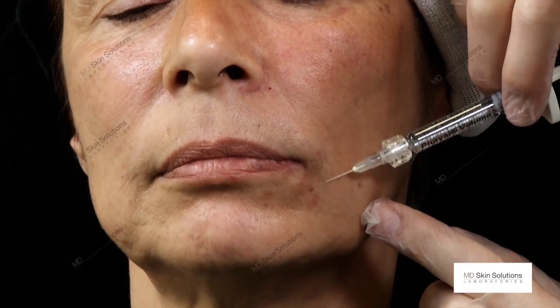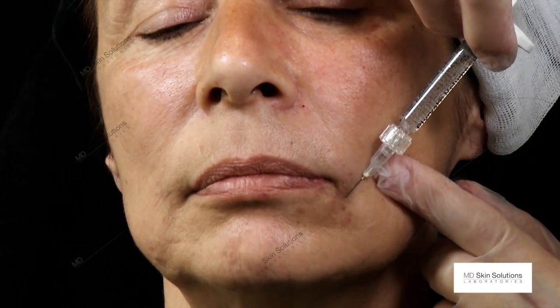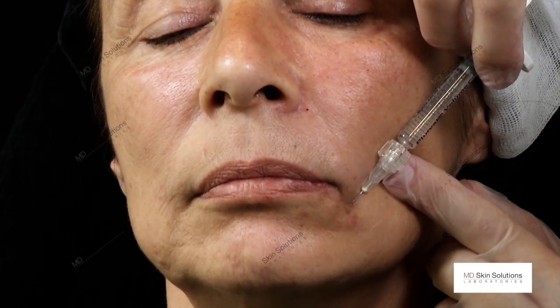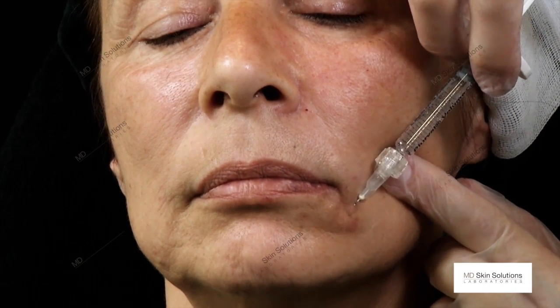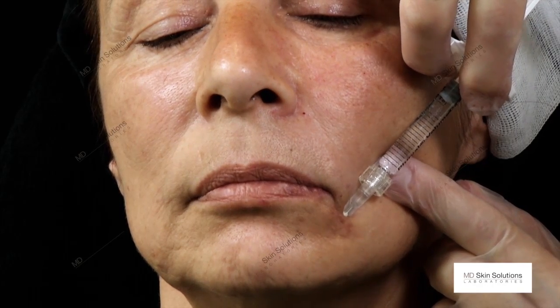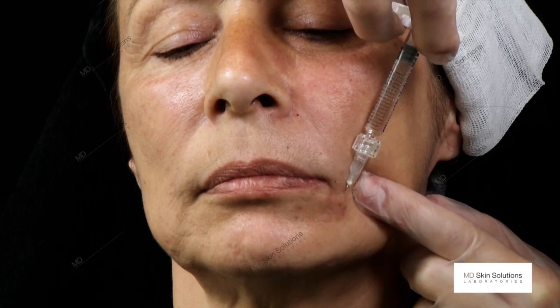The rest of the area to be filled is the prejowl sulcus. I go at the lowest, deepest point of this sulcus in a subdermal way, 45 degrees, height of the needle, and then put in a fanning-wise shape the material.